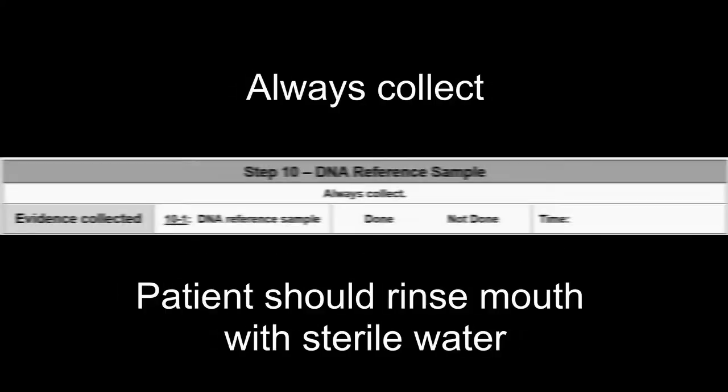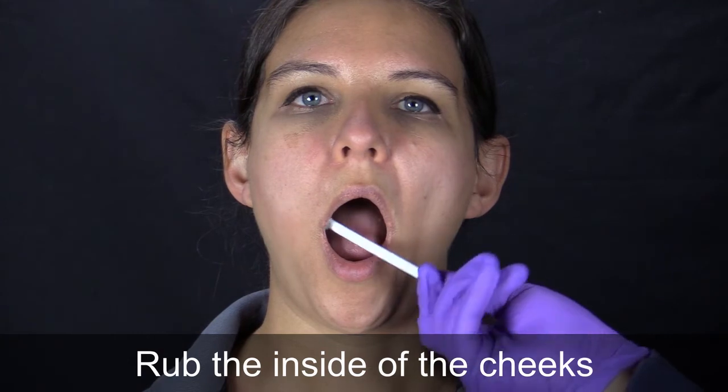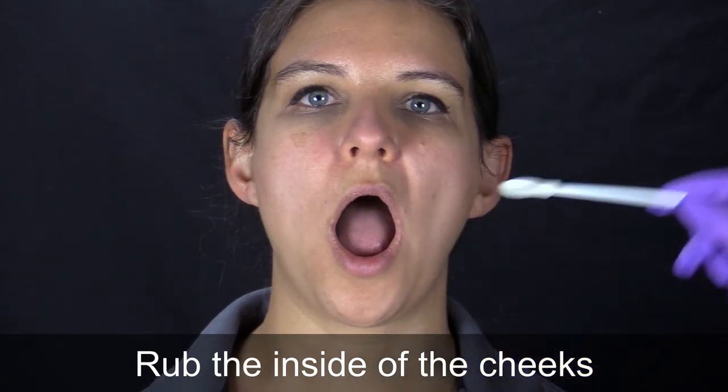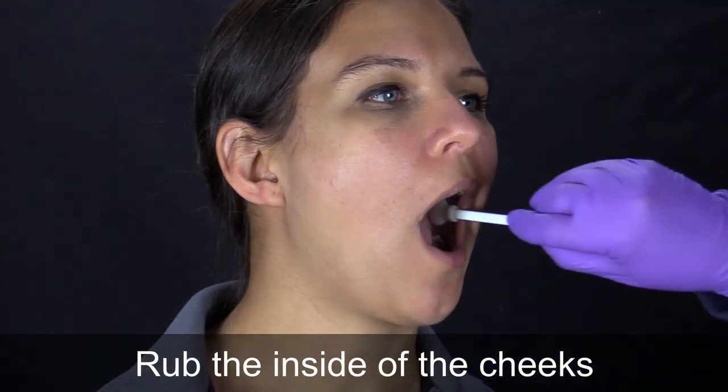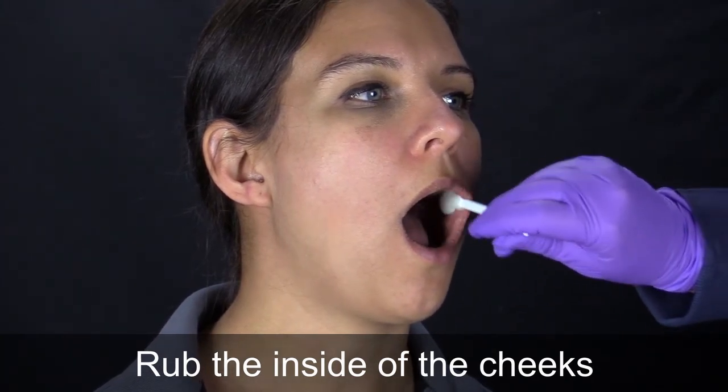Step 10, DNA reference sample. This step should always be collected, and the patient should rinse their mouth with sterile water in advance of sampling. The foam-tipped applicator is rubbed on the inside of both cheeks. This is done to collect buccal cells or cheek cells onto the applicator. This sample will be used as a known sample of the individual's DNA.